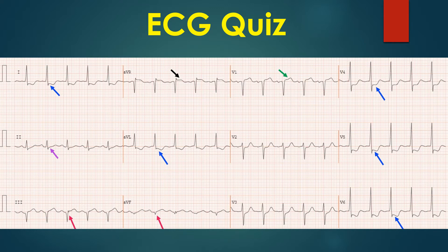QS complexes are noted in leads 3 and AVF, marked by red arrows. Minimal ST depression is seen in lead 2, marked by a violet arrow.